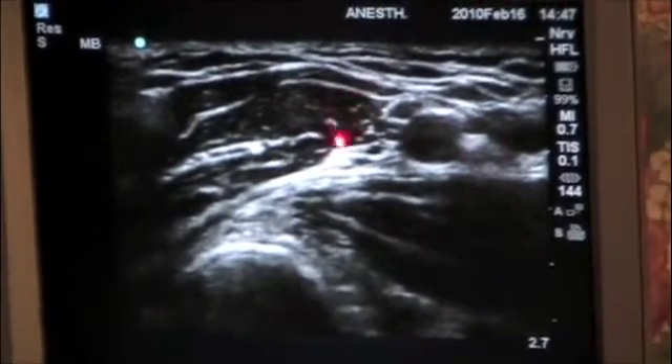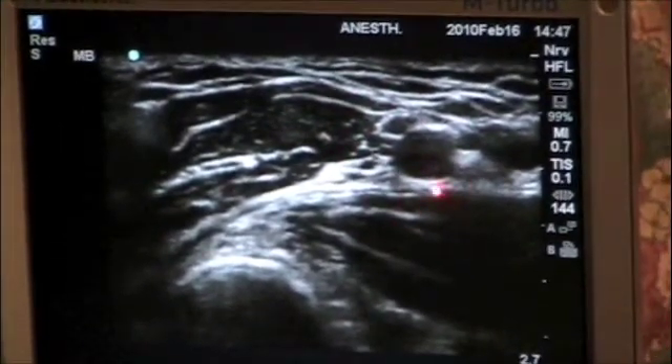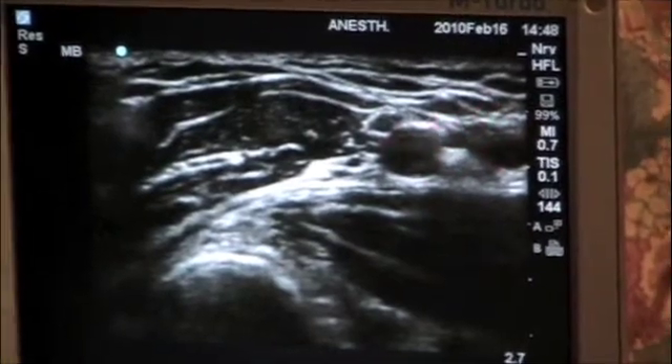In this patient, you can see the median nerve, the radial nerve — which is posterior — and the ulnar nerve, which is medial to the artery.